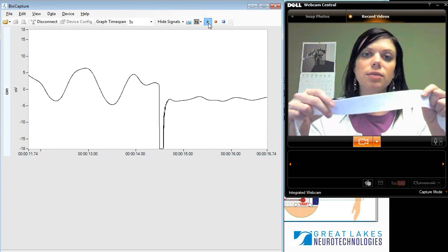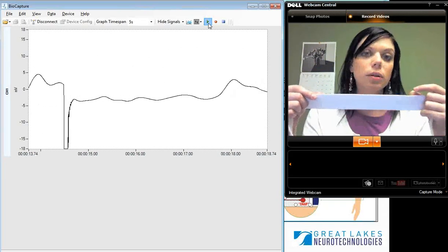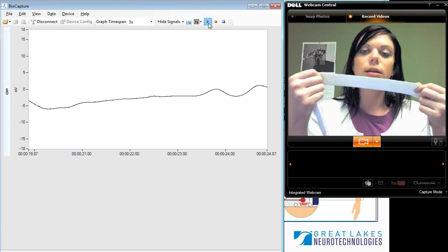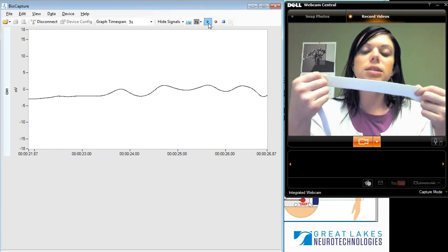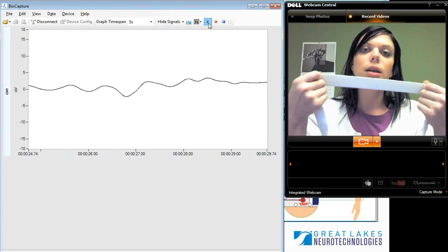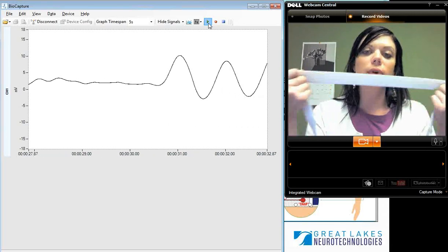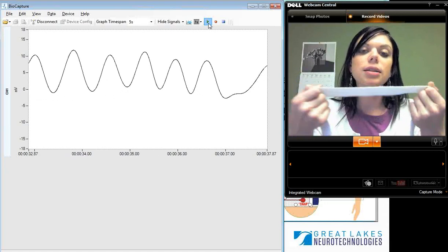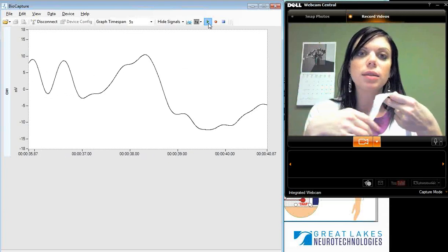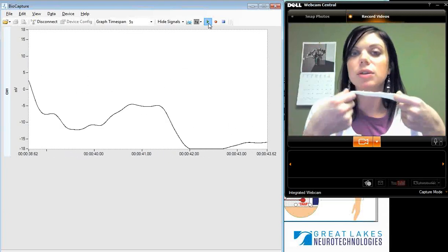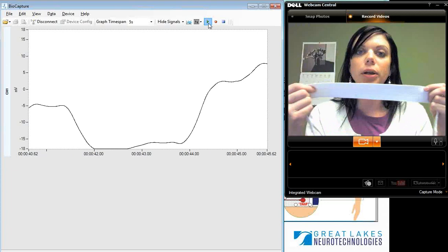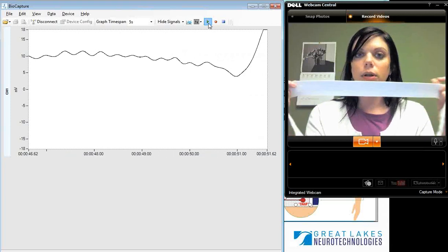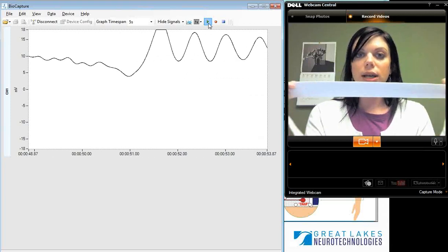Because of the inductive coil being used, RIP can even pick up very sensitive movements. Even if you just have the slightest tug on the belt, you're still going to see the respiration occurring. If somebody is taking normal larger breaths, you'll see a larger amplitude signal. The amplitude of the signal correlates with the strength of the breath — smaller expansions of the belt result in a smaller amplitude waveform, and larger expansions show a higher amplitude waveform.